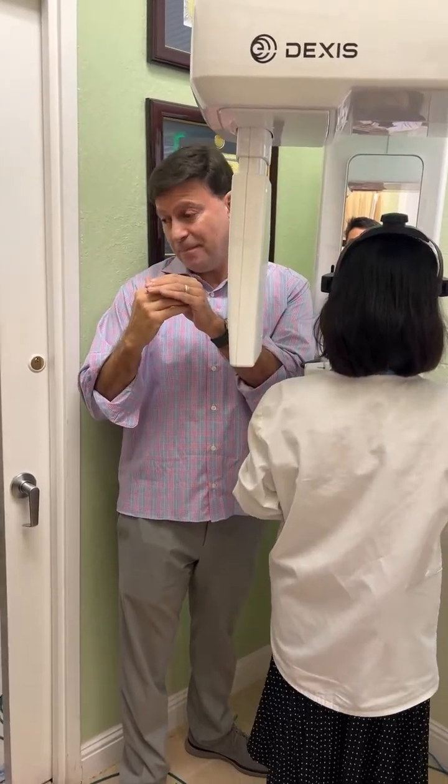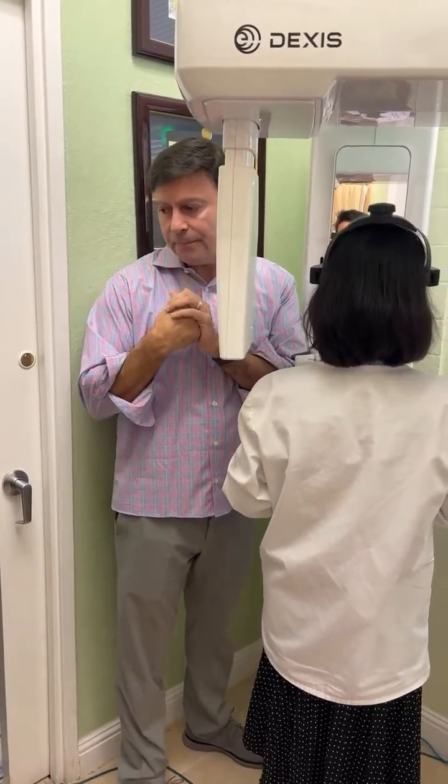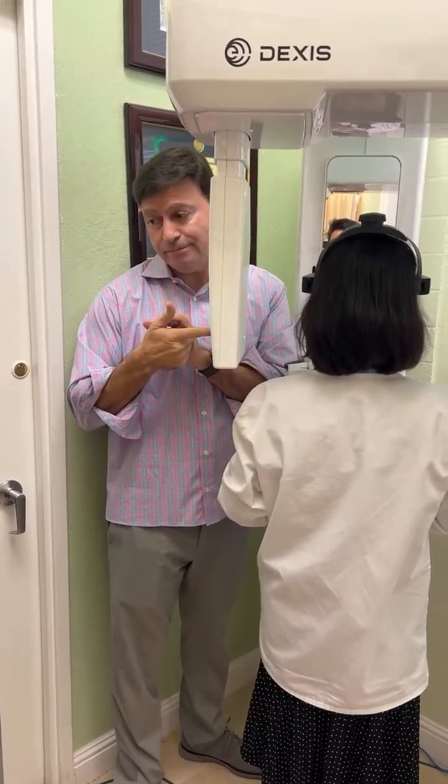It's going to happen. If that happens, do we have to retake it? Totally up to the doctor. Oh, okay. But it's not the machine's fault. Yeah, it's the patient.